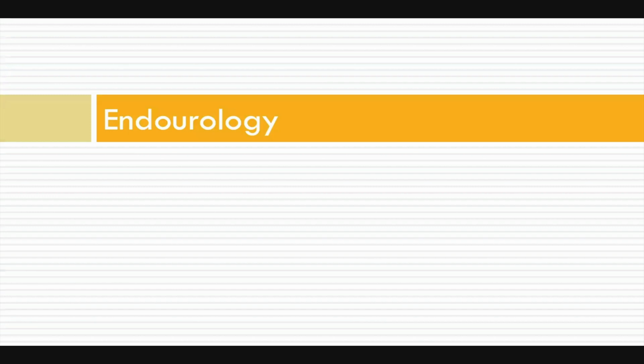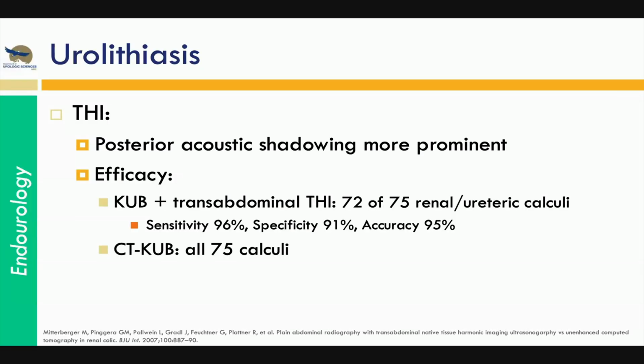Let's go through the clinical applications and the literature I was able to find for specific applications. So we often will get referrals for ultrasound showing stones, and in conventional B-mode imaging, it's just a little bit of posterior acoustic shadowing, plus or minus hydronephrosis, which tells us stone. Often it's not a very good image and very subject to size discrepancies.